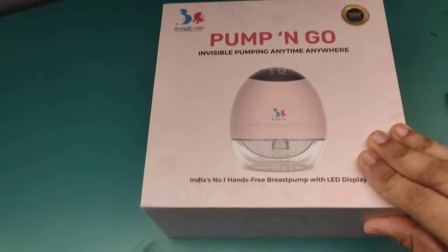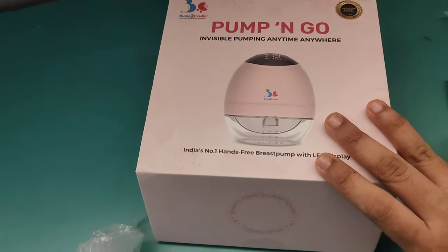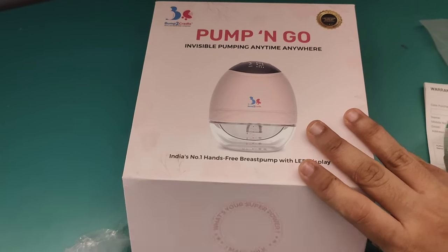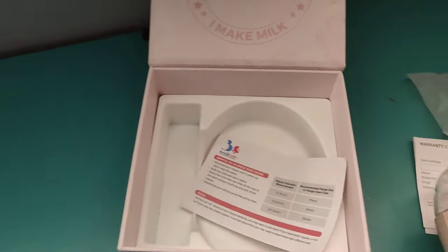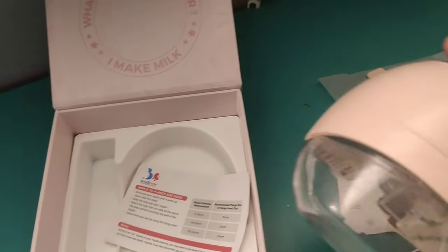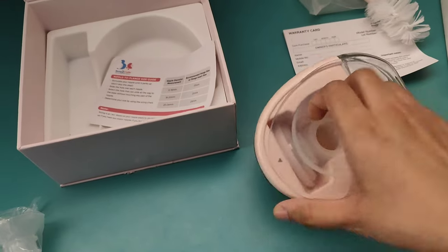Guys, this is the box which I got. The packaging is really awesome — I would give 10 on 10 for packaging. Now let's open it. I have removed everything. This is our pump which we have to use.